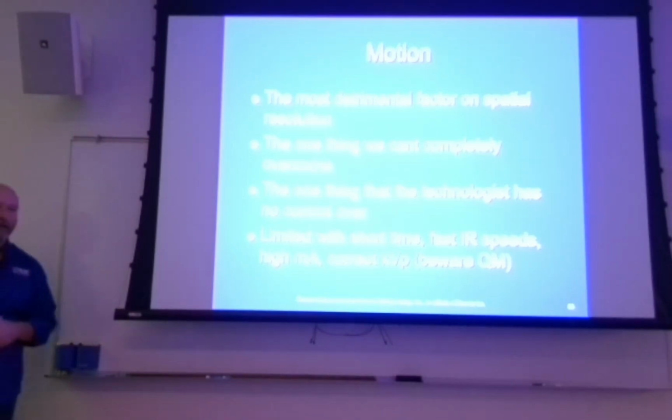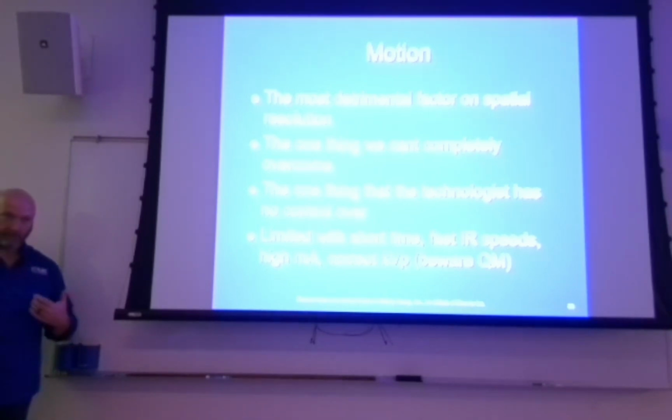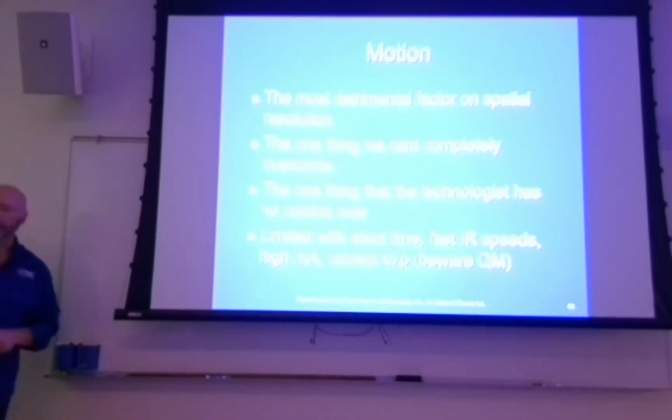What if you photo time? How could you reduce time? I think it might be a test question in context of how you might introduce quantum mottle. The density. Okay, density controls, you can increase or decrease your exposure time, but what if you increase kVp? What's going to naturally happen if you increase kVp in your photo time? Decrease mAs. You're going to decrease mAs, overall mAs. And typically that's going to reduce time, exposure time specifically.